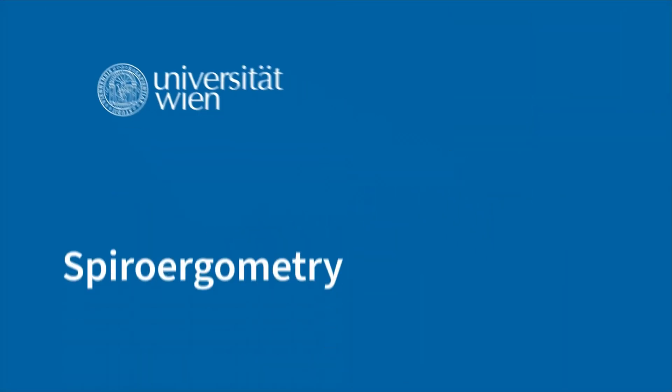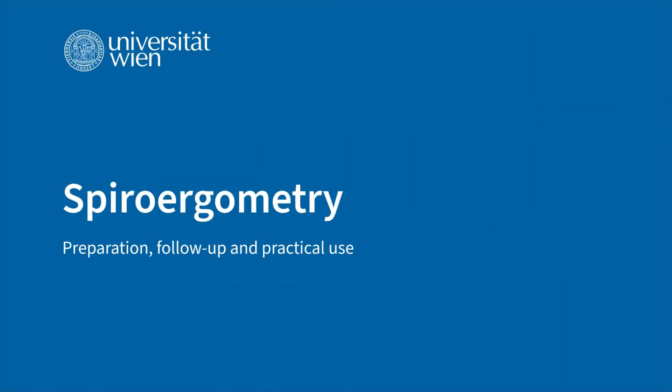In this video we introduce you to spiroergometry with preparation, follow-up and practical application.